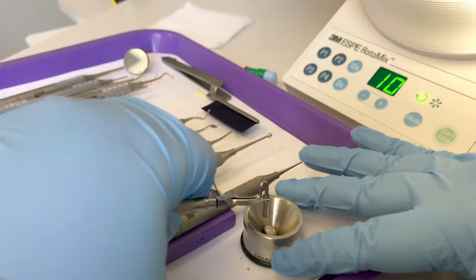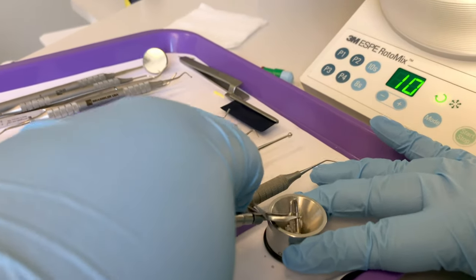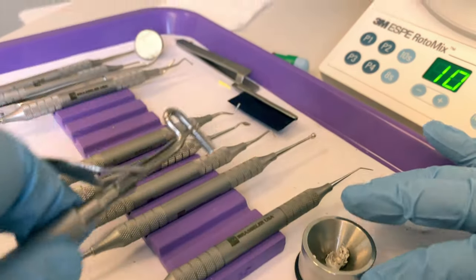Take your carrier and load the amalgam into your carrier. I like to hold the well firmly in one hand as I press the carrier into the mix with the other. If you're using a double-ended carrier, make sure you fill both ends. Once you have filled your carrier, we deliver it to the dentist.